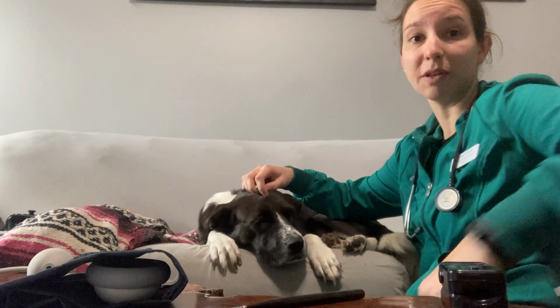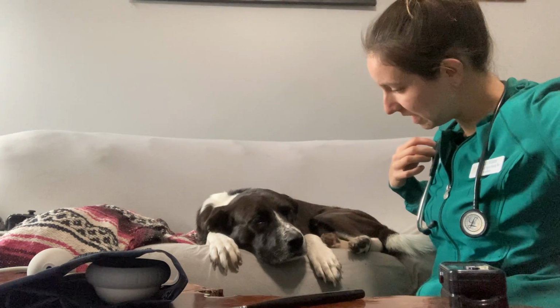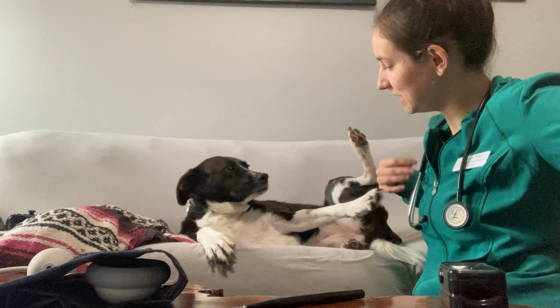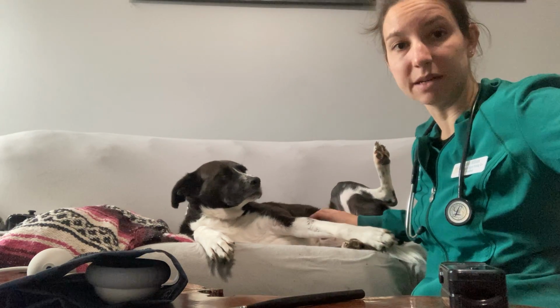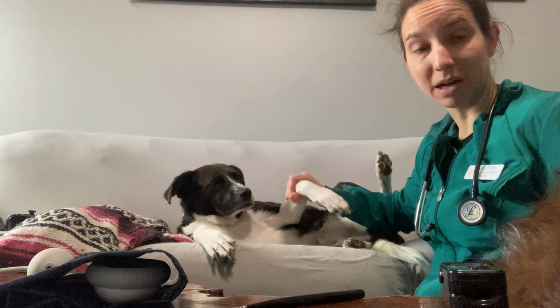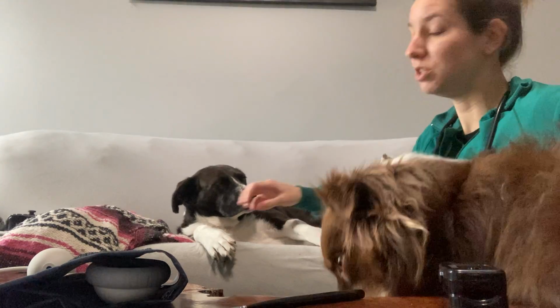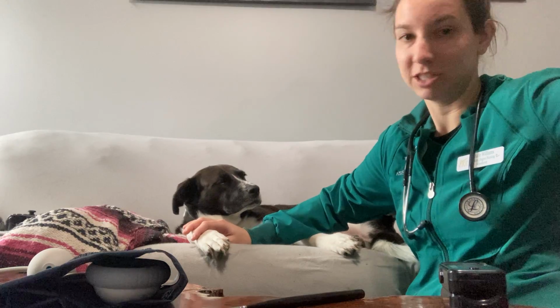So I like starting with pain as the first of the vitals. Sadie, are you in any pain today? Pain might be one of the ways that we dictate any limitations or variations of our vitals. For example, if Sadie had pain in her left arm, I would not be taking blood pressure on an arm that already hurts. We would use her right arm, Nova, go over here, to take her blood pressure.